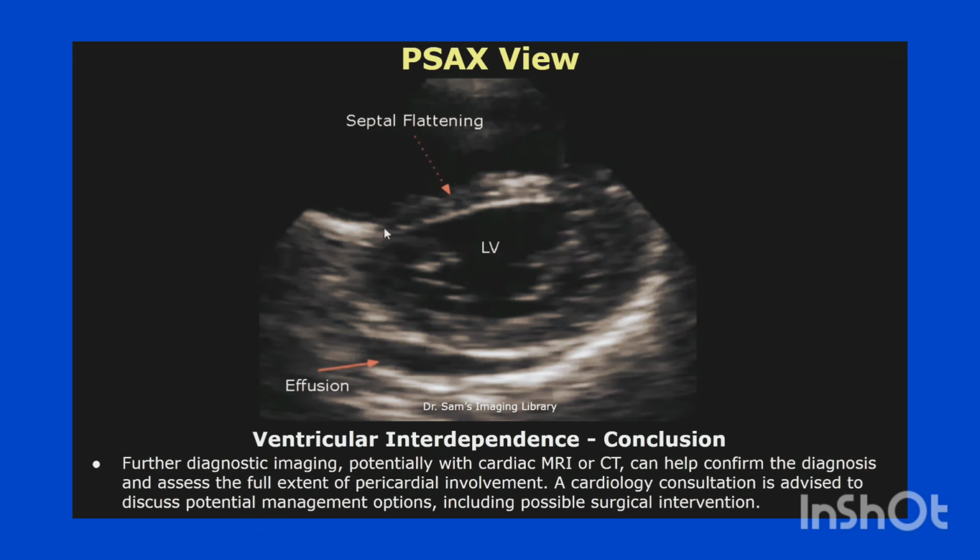Further diagnostic imaging, potentially with cardiac MRI or CT, can help confirm the diagnosis and assess the full extent of pericardial involvement. A cardiology consultation is advised to discuss potential management options, including possible surgical intervention.